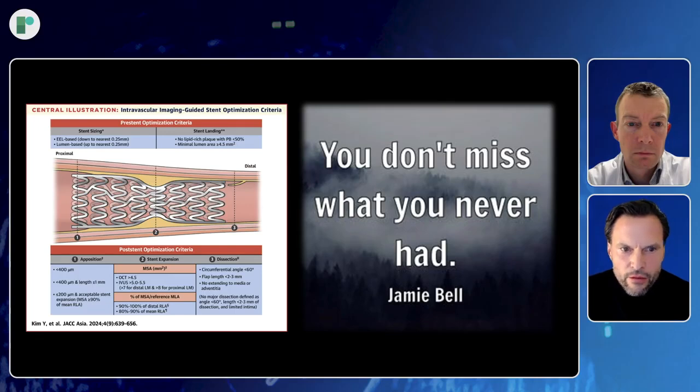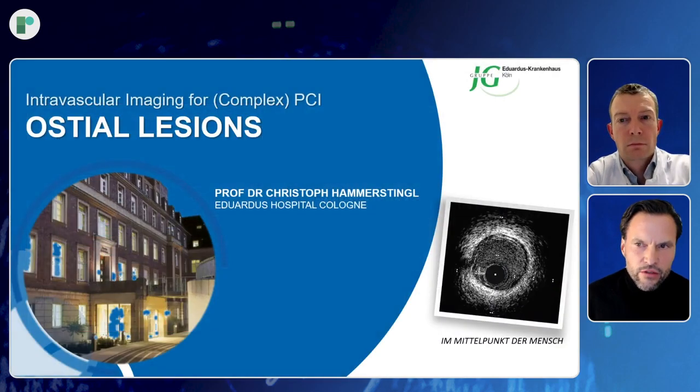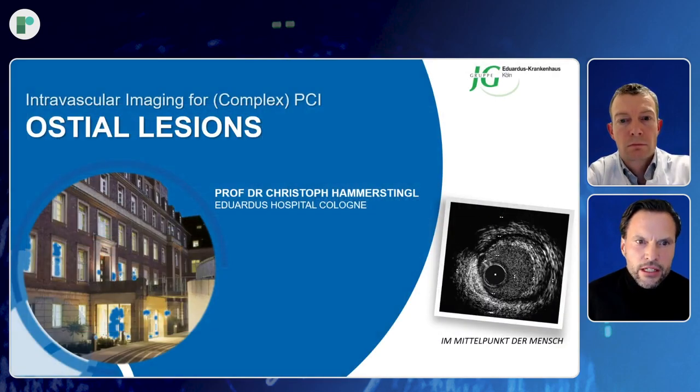So from my point of view, we might not really estimate the total amount of complex situations if you don't apply intravascular imaging more in daily routine.